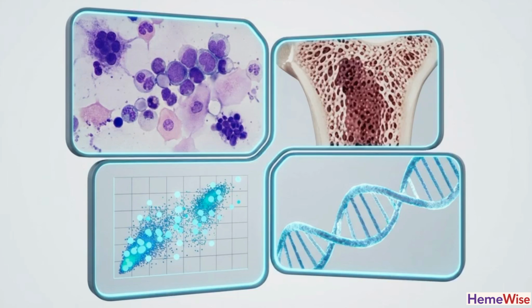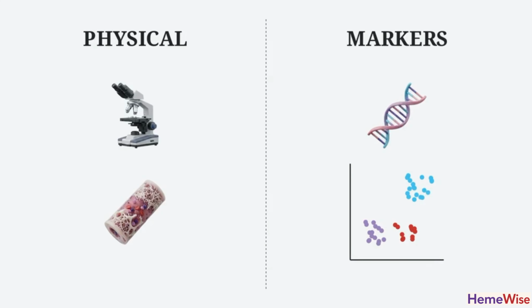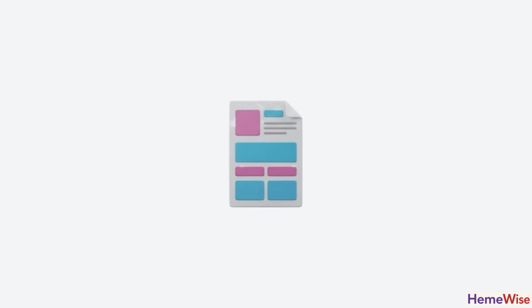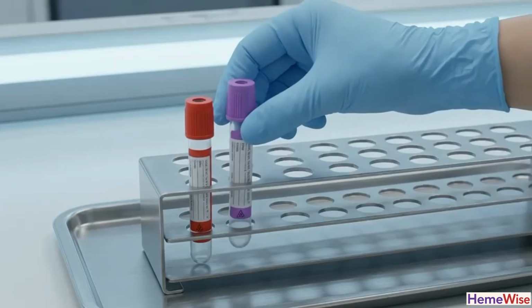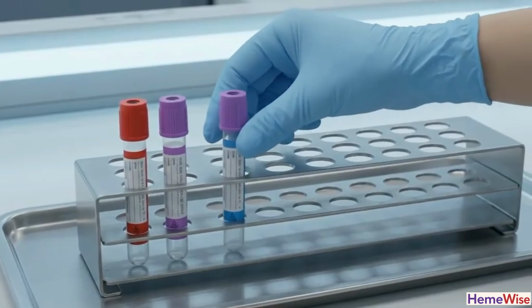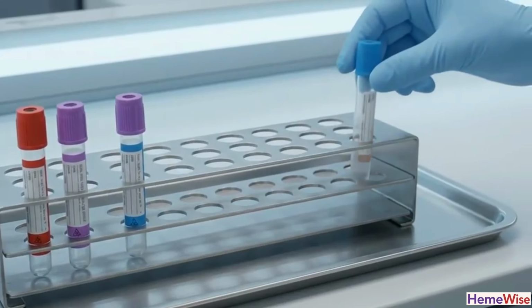Modern hematopathology relies on the integrated marrow report, where physical morphology, architectural data, and digital sequences are aligned. Morphology and architecture establish the physical presence of the disease, while ancillary tests like flow cytometry and molecular PCR provide the specific genetic and immunophenotypic markers. Because flow cytometry and cytogenetics require viable, non-fixed cells, sample allocation must be planned before the procedure begins to ensure no diagnostic material is lost.